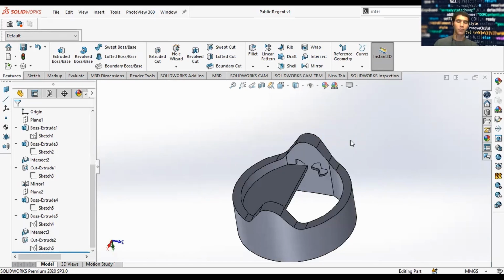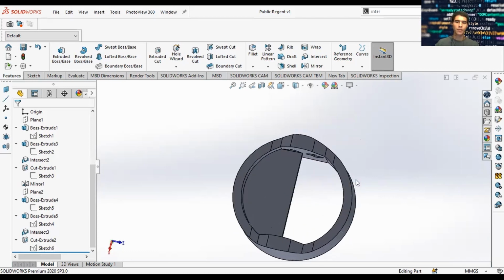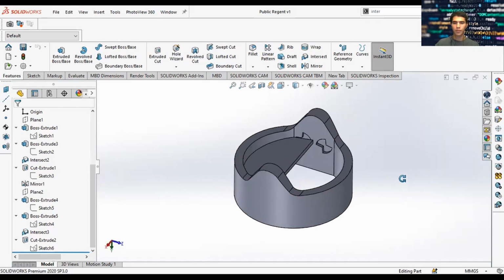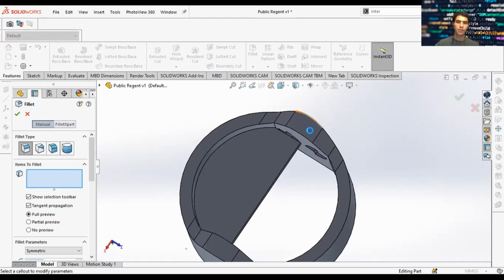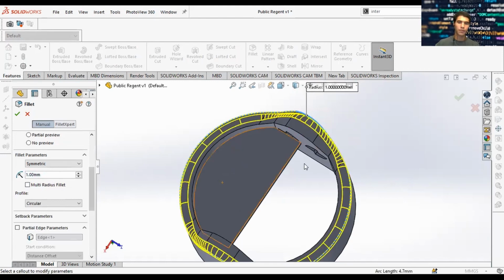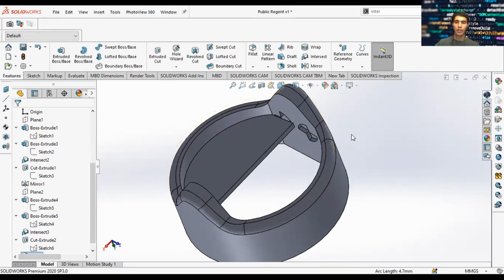So fillets. With fillets, the rule of thumb is that you want to begin from the highest fillets to the smallest fillets. So start with your bigger edges. And to do that, just go here under fillet and choose the fillet edges you want to do. So we have one. We fillet once, and then we'll fillet on the inside now.